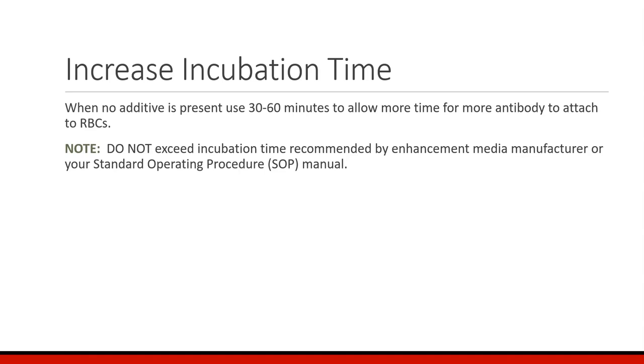What's very important to note is you do not exceed the incubation time recommended by the enhancement media manufacturer or your standard operating procedure manual. Most manufacturers, for example for LISS, I believe the maximum is 20 minutes. So be very careful that you always follow the SOP.